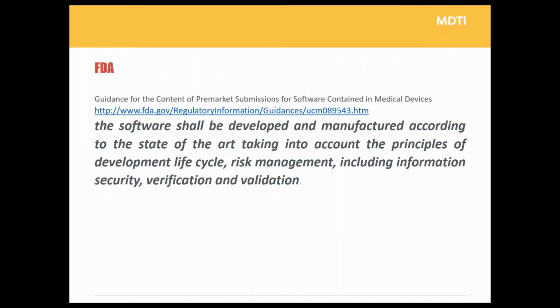But I think the quote here is worth focusing on and understanding. So that software shall be developed and manufactured according to the state of the art, taking into account the principles of development, life cycle, risk management, including information security, verification and validation.